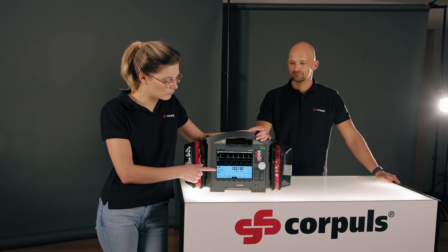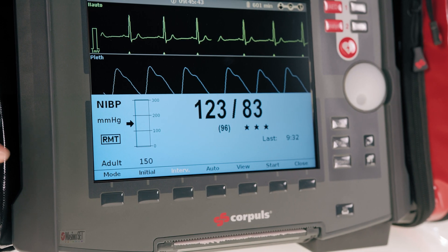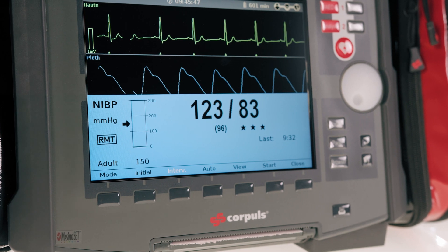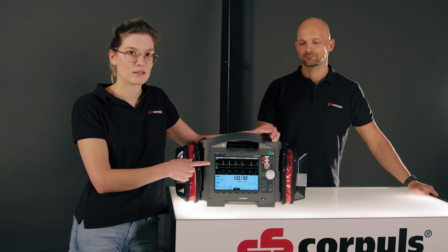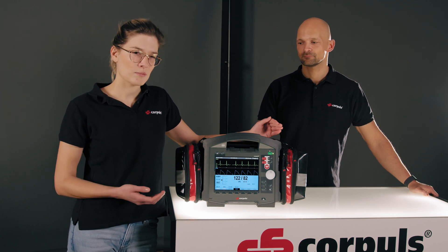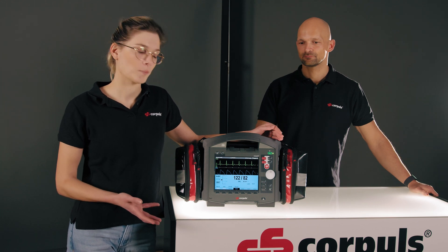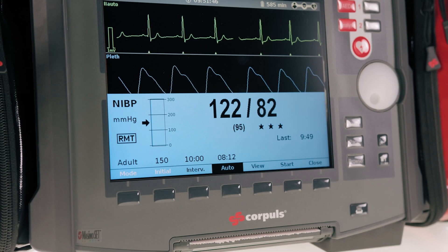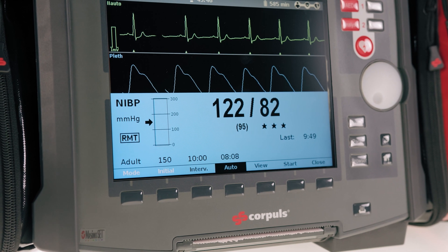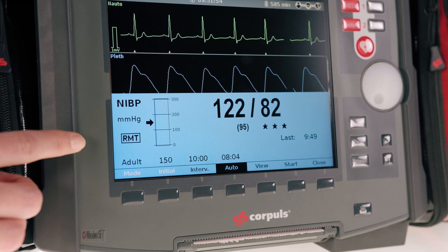What you can also see here is the RMT icon. This means the RMT is active, which is automatically the case as soon as I have also performed a basic ECG on the patient. The R peaks of the ECG are compared with the pulse waves from the blood pressure measurement, which can improve the quality of the measurement and artifacts on the blood pressure side can be filtered out. However, if there are too many artifacts in the ECG — for example during transport — the blood pressure measurement would be unnecessarily long. In that case, I would disable RMT.